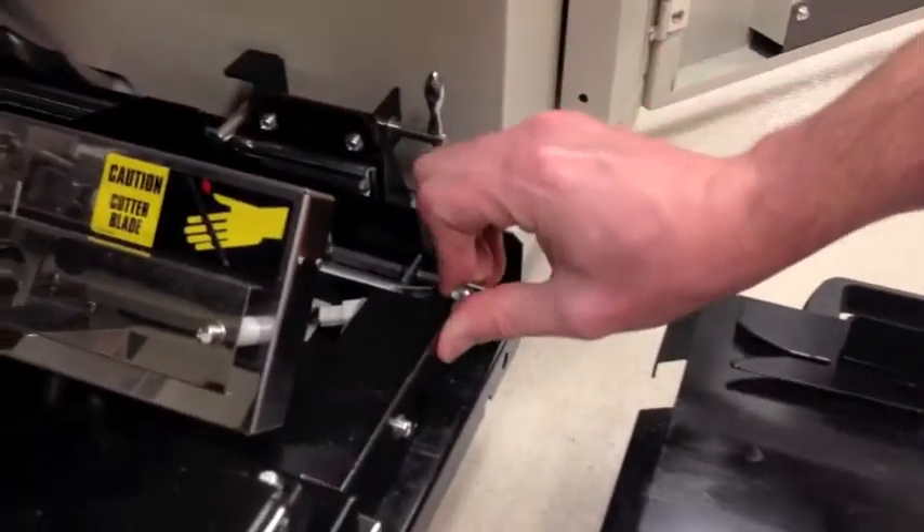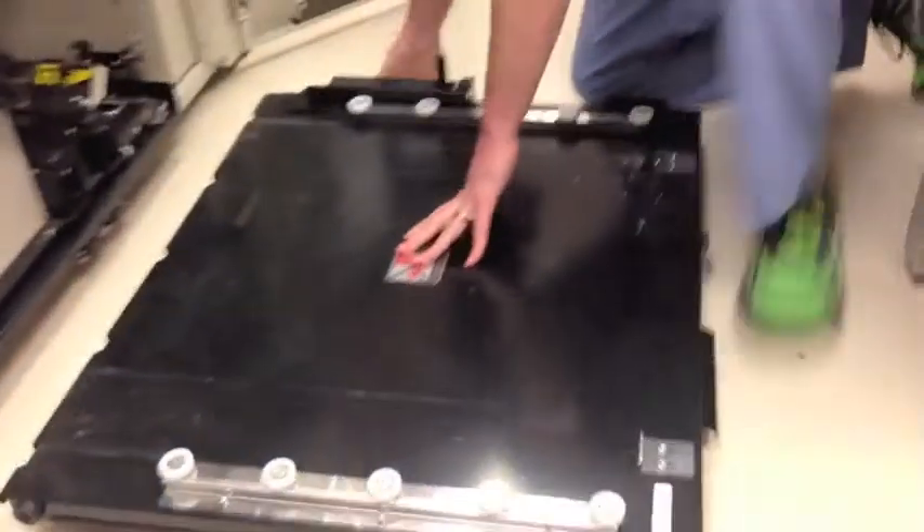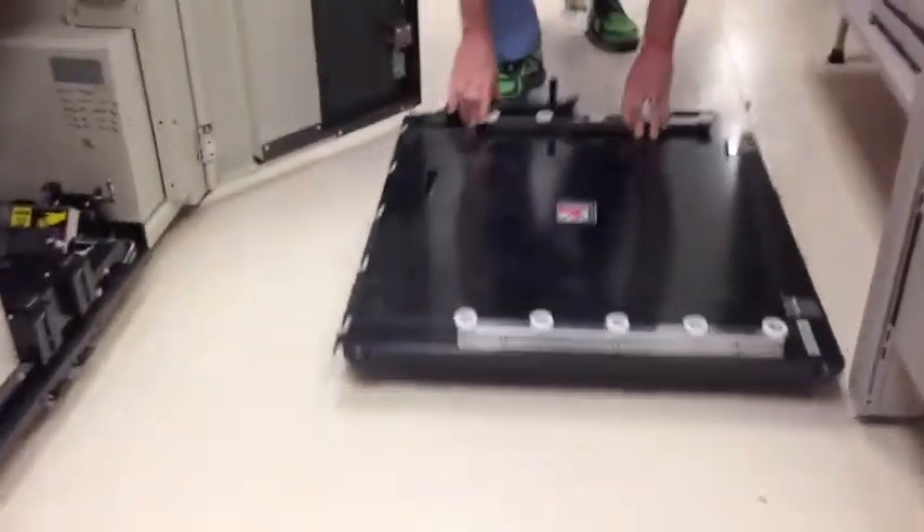After it plugs in at the back, you should hear an electronic noise as the printer reboots. Push down the two levers, wheel away the trolley, and close the lower doors.